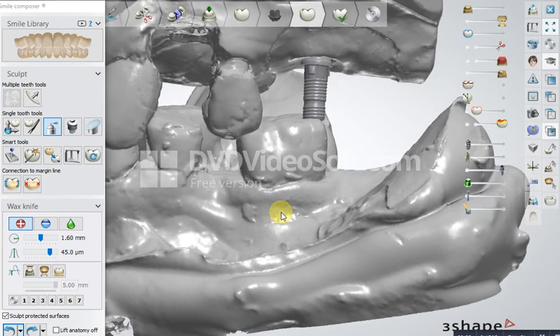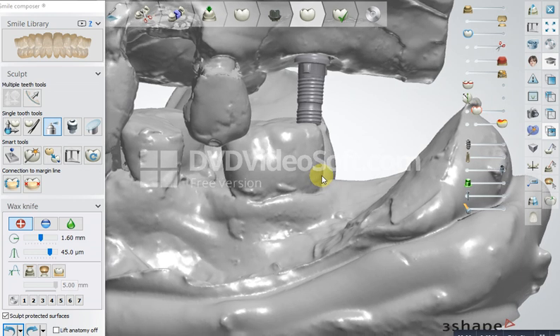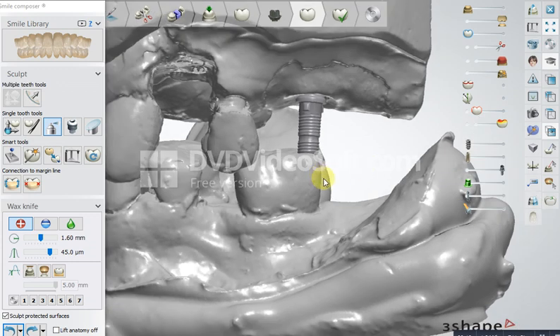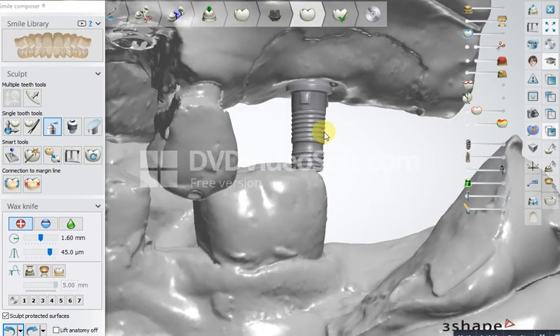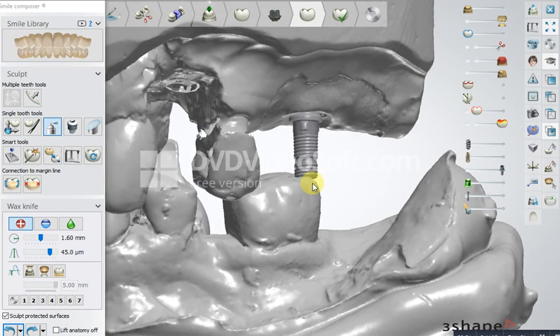Hello, good day everybody. In this video I'm going to show you a quick solution. Sometimes when you receive a die scan and the type base is too high, it is touching the opposing, and you have to print the model and then risk cutting the type base.